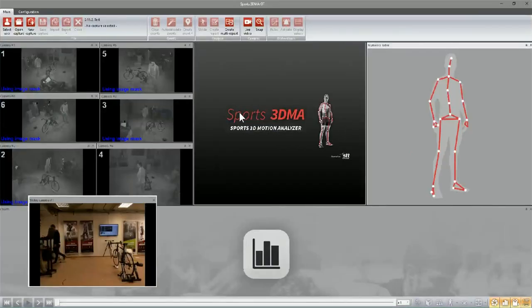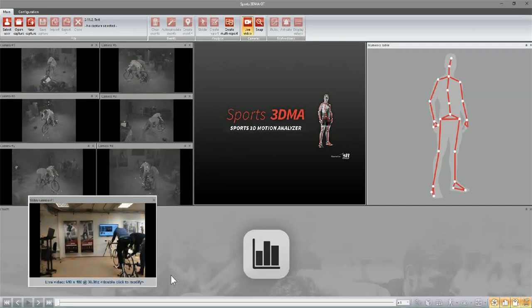Okay, let's get back to our scene. We can see here how the markers are being placed. This is the bike fitting protocol for 2018. So we're using 3 markers on the floor. And in the upcoming 2019 protocol, there will be no need to place markers on the floor. Body markers will be the same, but no markers will be placed on the floor, which is very convenient.